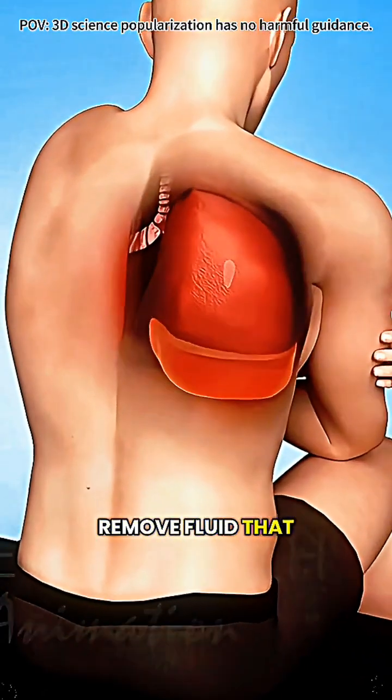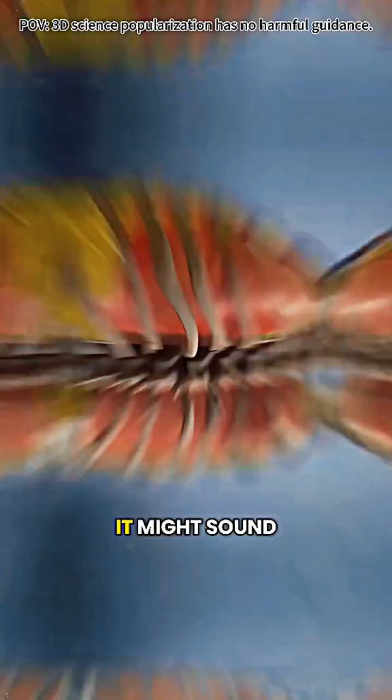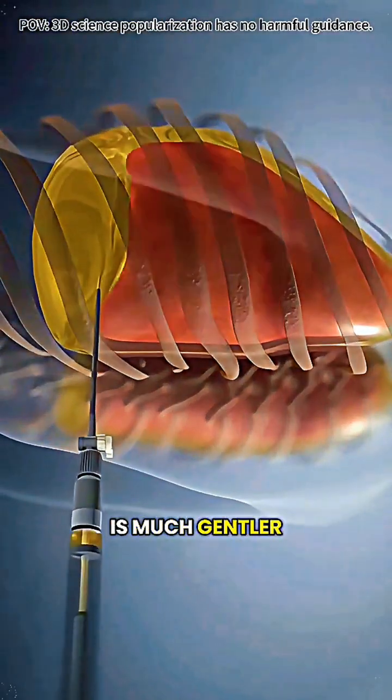Have you ever wondered how doctors remove fluid that builds up around the lungs? This procedure is called a thoracentesis. It might sound intimidating, but the process is much gentler than you'd expect.